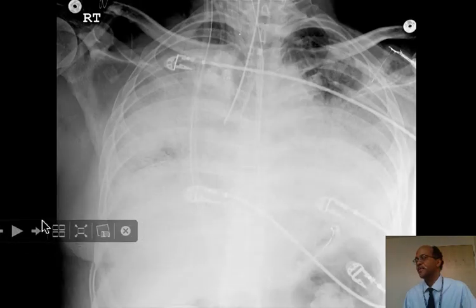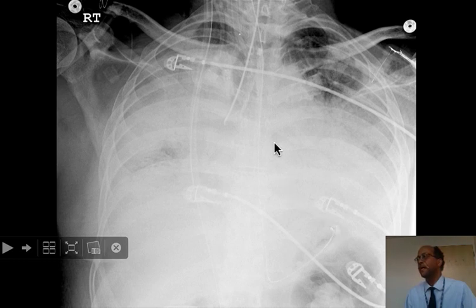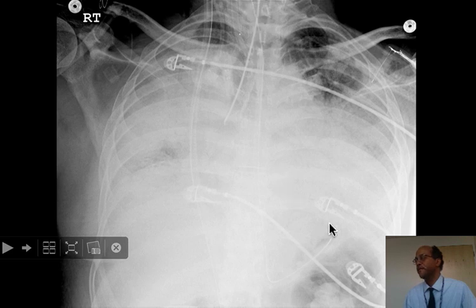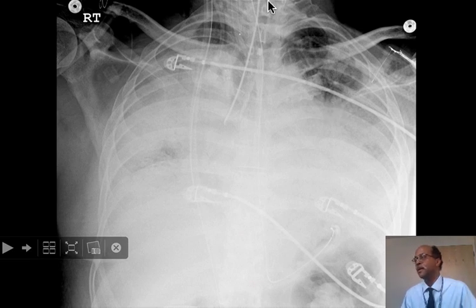Here is the last case we're going to show. We can see that there is a nasogastric tube, and that is correctly positioned. It's frequently hard to see the tube in the mid-portion, but it's easy to see it up in the neck, and we confirm its end position in the stomach. But in this patient, who has severe pulmonary edema and florid alveolar consolidation requiring intubation, we can see that the endotracheal tube has slipped down into the right main stem bronchus.